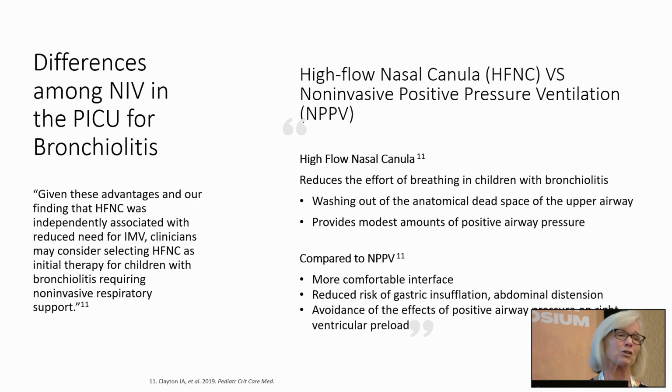The other big difference between high flow and non-invasive positive pressure is that it's so much more well tolerated by the patients. The kids aren't trying to knock their mask off their face. I had one patient tell me, it feels like you're trying to smother me into breathing. We can imagine how uncomfortable that is until they learn how to let it breathe for them. So because it's a more comfortable interface, they're not trying to knock it off, you're not having to use as much sedation, there's also less gastric insufflation, so their belly's not blowing up and fighting against the diaphragm when the diaphragm's trying to take a breath.